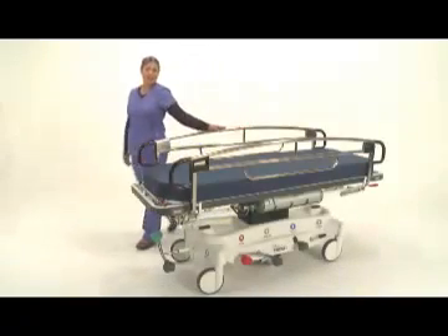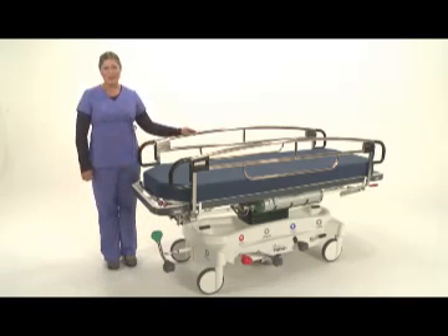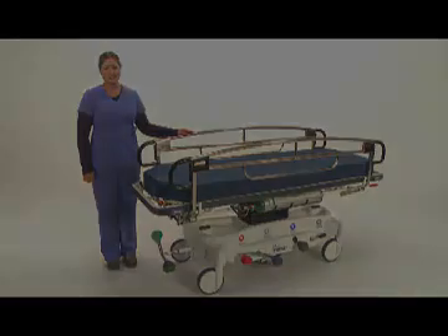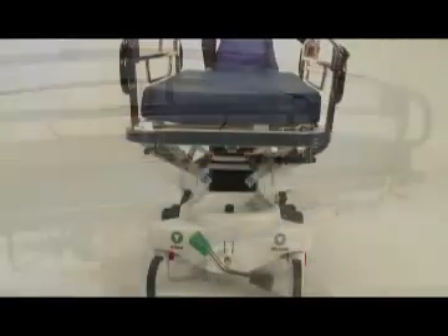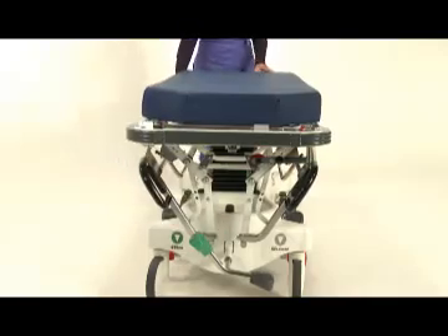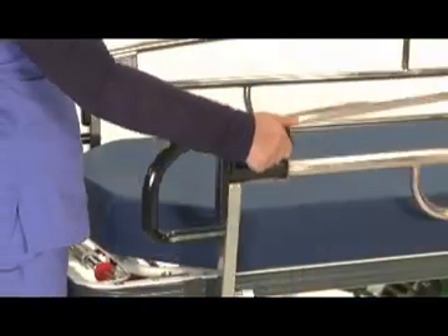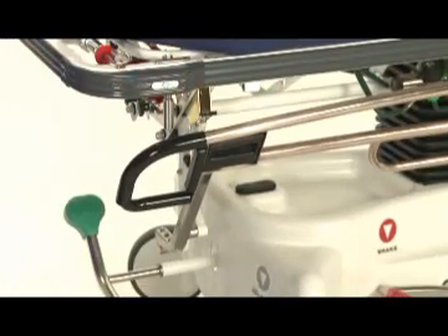The most important feature of the 7500 stretcher is our full length stainless steel side rail. Pedego is the only company that offers a full length side rail to ensure safety for both the patient as well as the caregiver. Built-in release handles are visible at all corners of the stretcher and make for easy one hand operation. Side rails glide downward and out of the way giving full access to the patient. Unlike scissor collapsing side rails, the articulated motion of the Pedego rail reduces the likelihood of pinching or pulling IV lines away from the patient.